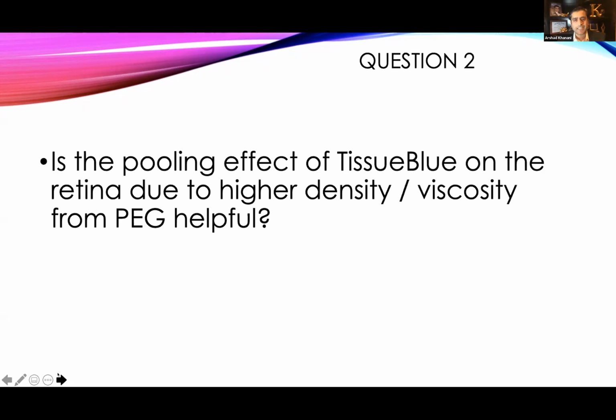And what cannula do you use, Carl, to put the Tissueblue? And do you stay inside, or do you come out of the eye for 30 seconds and then go remove it? We'll put it on a 25 gauge needle, because I'm not injecting deep into the eye, just into the mid-vitreous. And I do come out because I don't like to leave it there. I set the timer on our vitrectomy machine, and it counts for 30 or 45 seconds usually, and we irrigate it out without an issue.